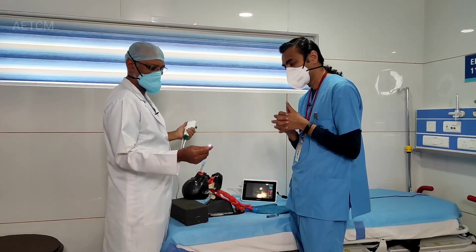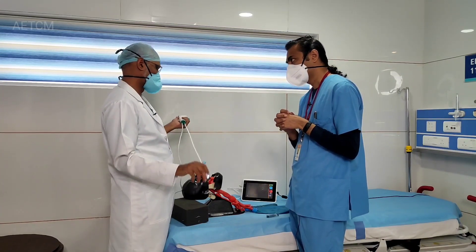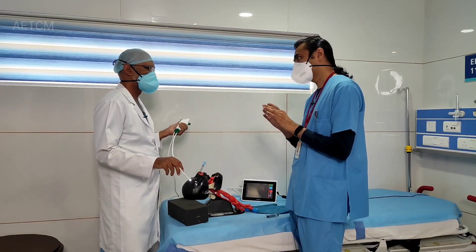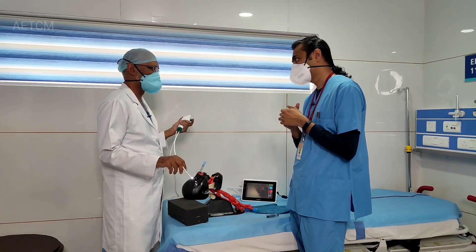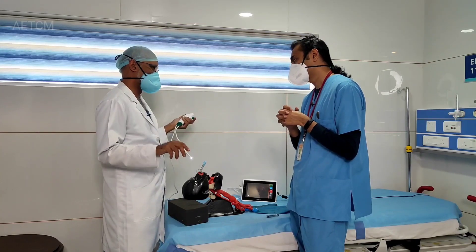Another scenario is a mucous plug — the same equipment can be helpful there. But the plug may not come out easily because it depends upon the channel size, so you may have to use a slightly bigger scope. You use a bigger scope, identify the mucous plug, and use suction to extract it. If it doesn't come out, give a flush so that it becomes a little loose and then you can pull it out.